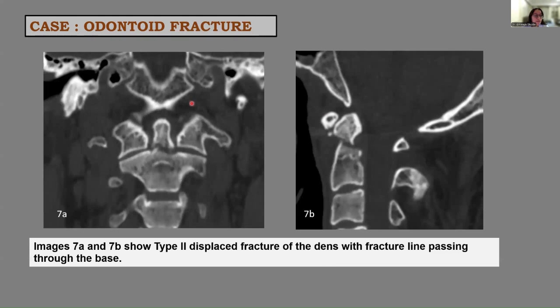This is a case of trauma. Images 7A and 7B show a type 2 displaced fracture of the dens with a fracture line passing through the base. In our study, this type 2 fracture was the most common type.